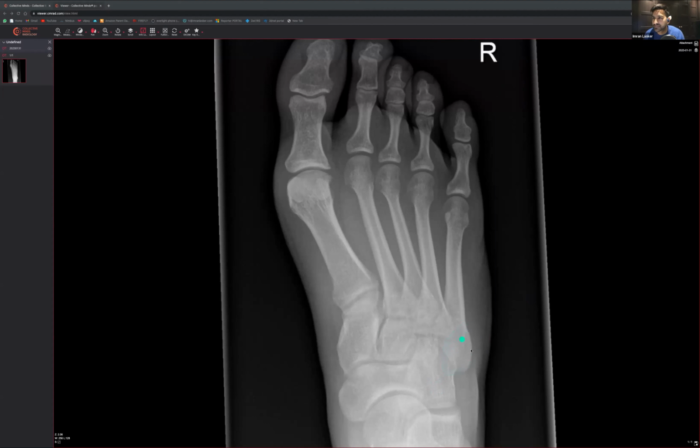Label as thumb, index, middle, ring. This removes any doubt. Yeah, I've seen that. I've seen both, actually. Someone is saying that they normally label it thumb, index, middle, ring, and little finger, and that does remove any doubt. I'm not saying either way is correct, and you are correct that will remove any doubt.